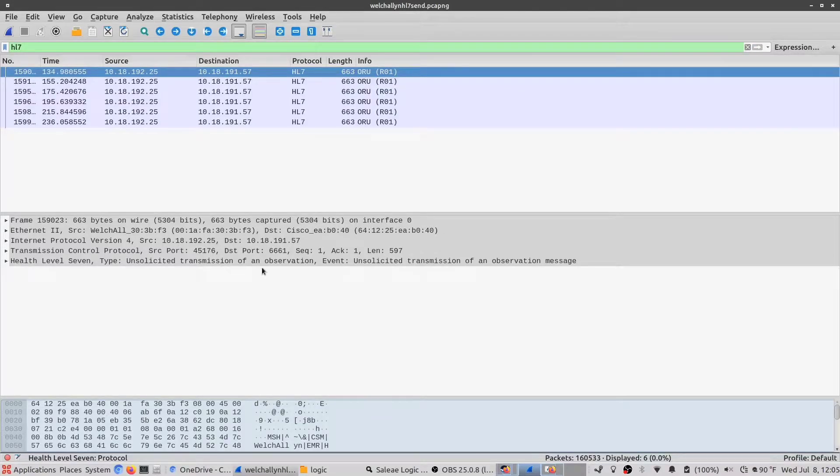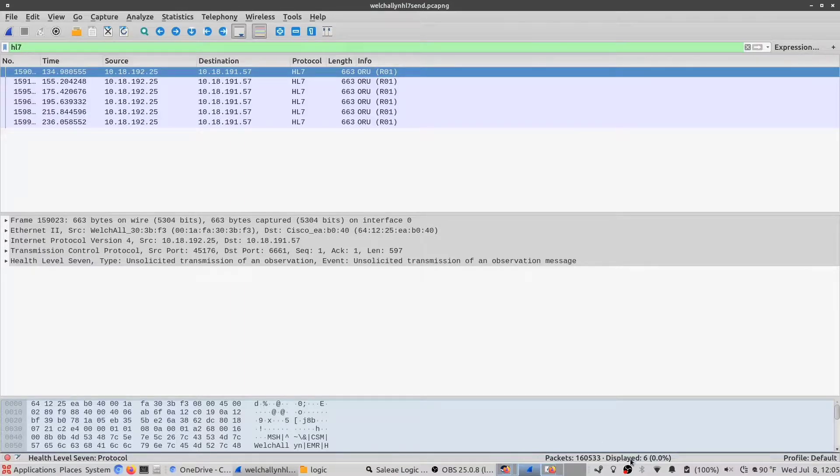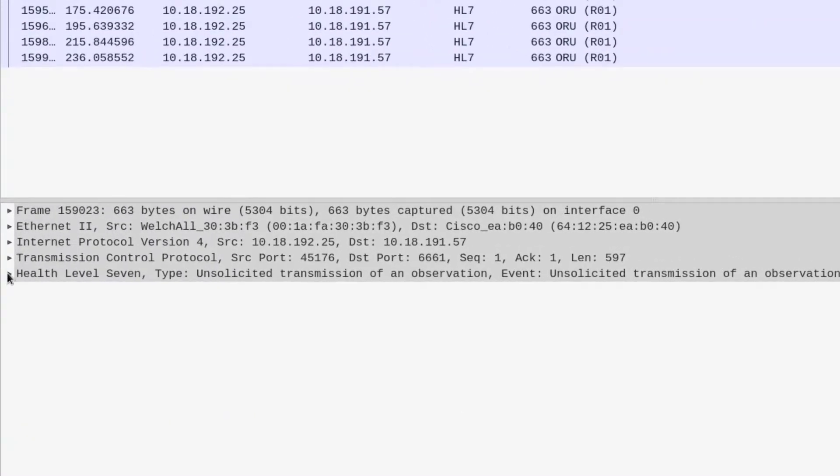These packets here are packets that have been sent by the Welch Allyn to MirthConnect to be interpreted. These are the raw packets that have not been interpreted.